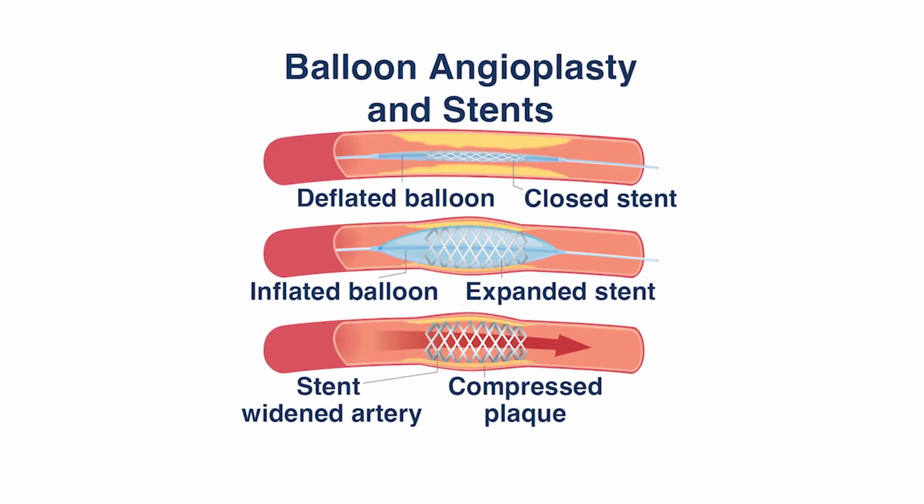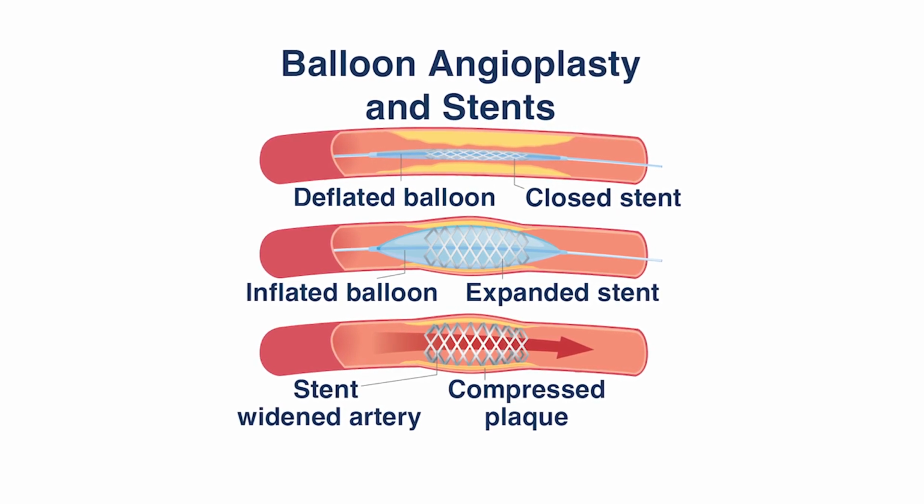One is potentially advancing an ultrasonic camera inside the artery to look at the vessel size as well as the amount of plaque, what the characterization of the plaque is, quantify the amount of calcium, and then decide whether any further interventions need to be done before we put a stent in. Once we deem whatever we need to be done about that particular lesion is complete, then we proceed with putting in a stent, a metal mesh-like device to pop open and keep that area that was blocked open for as long as possible for the patient.